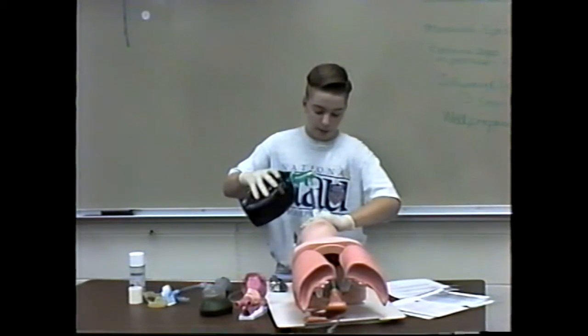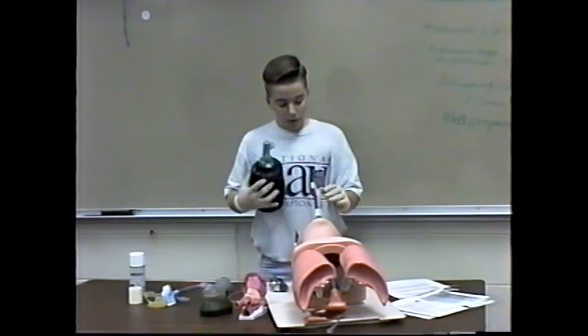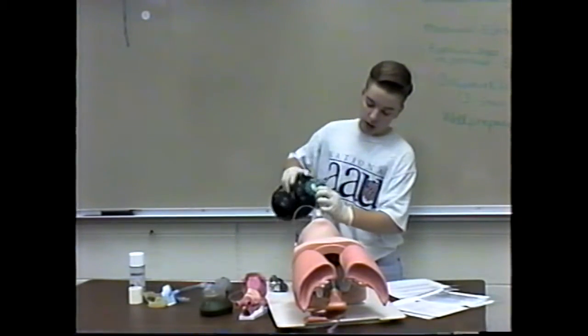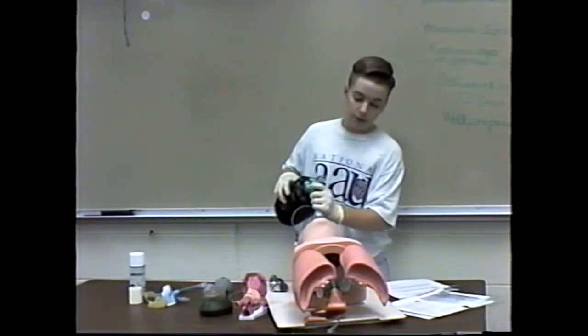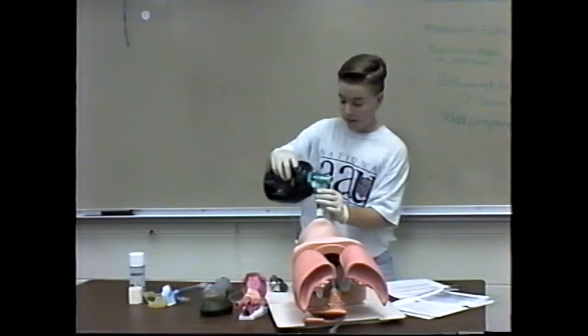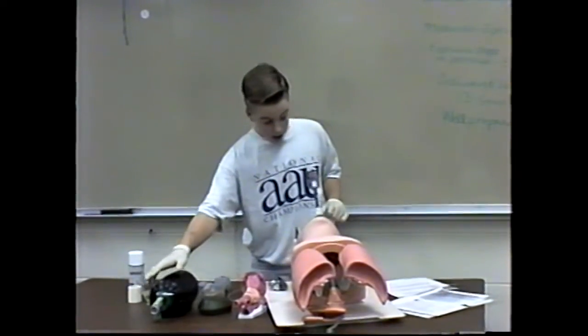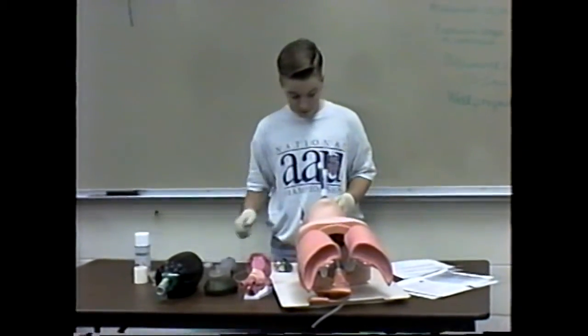Like I said, it's got a hole in it, but you can kind of see the lungs moving. Or if it's not in the lungs, you do the clear one, which is in the stomach, which you don't want. And this is it for the combo tube.